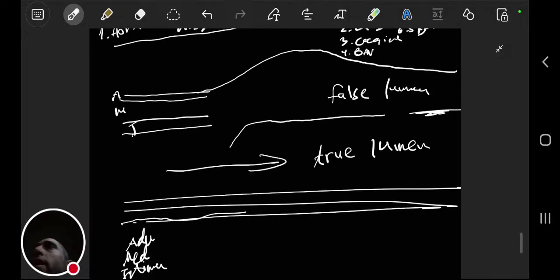Anyway, what we see, starting with this, is an intimal tear. As you see right over here, there is an intimal tear. And what you see right over here is called a flap, an intimomedial flap. So let's call it a flap, a tear in the intima. Then the blood can go right over here. Instead of flowing in the true lumen, it goes to flow in the media, I mean in the false lumen.